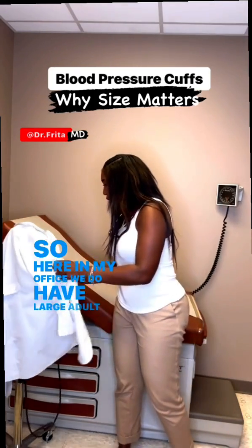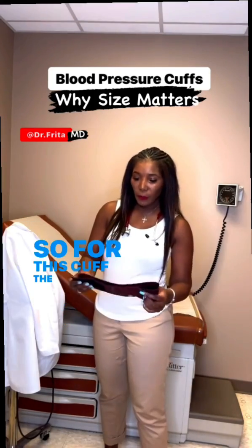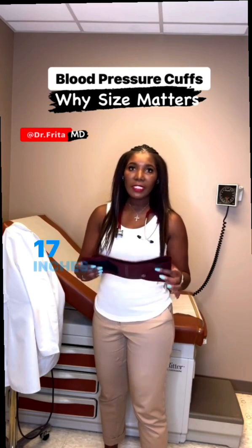Here in my office, we do have large adult cuffs. For this cuff, the range is about 12 and a half inches to 17 inches.